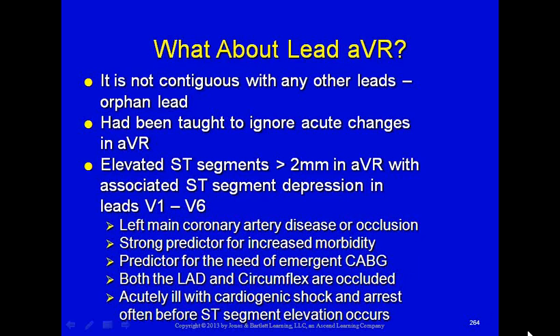AVR, if you noticed in the diagram that we just looked at, there was no mention of AVR, and I was always taught that AVR is an orphan lead, that it looks off to the right when we want to be looking to the left where the heart is. It looks off to the right side, and I had always been taught that it's an orphan lead and we don't do anything with it.